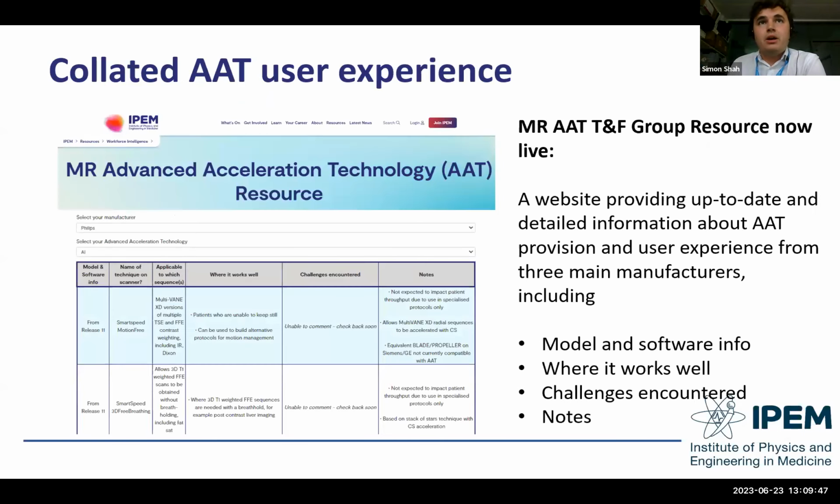We have a live website now. I believe at the moment it's currently only available for IPEM members, but this is going to be changed. And it provides a bit of advice in terms of what the technology is, which manufacturer we've got, which type of acceleration technique, what software versions it's available on, what the challenges are, where it works, and some notes. And these will be updated over time as well. So as and when we get more and more information, as more and more people are using this software and feeding this information back, we'll be able to update this.